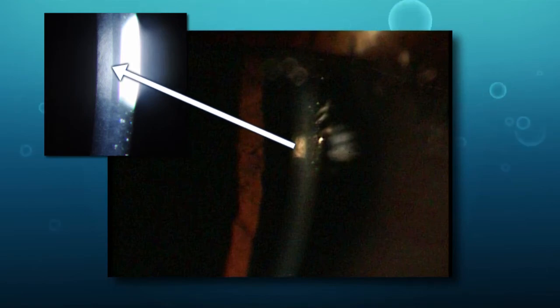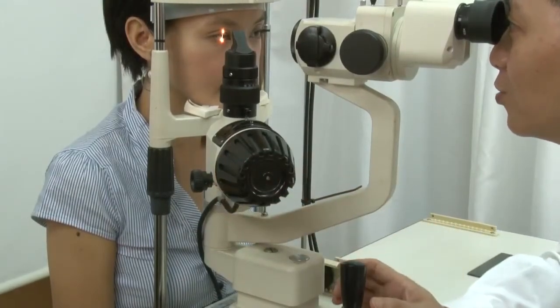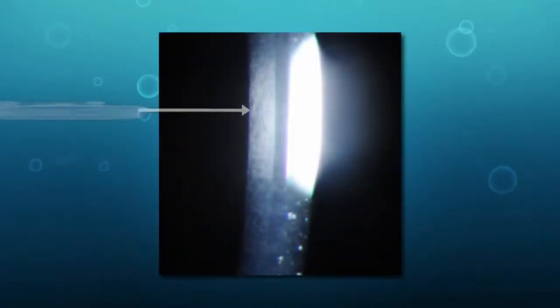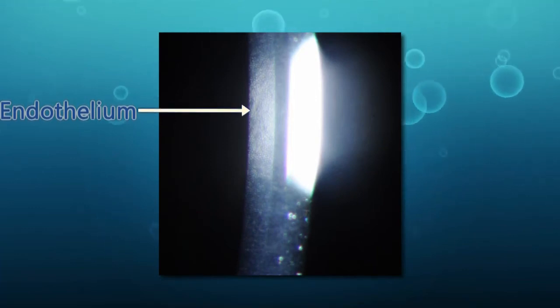A bright specular reflex should appear on one ocular eyepiece. Zoom to the highest magnification. A bright image can be seen with a dull image adjacent to it. Adjust the joystick slightly to focus the dull image to bring the endothelium in focus. Specular reflection is primarily used for viewing the endothelium. Its structure looks like a mosaic pattern.